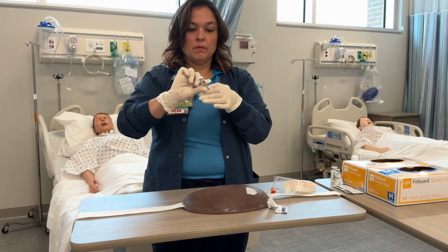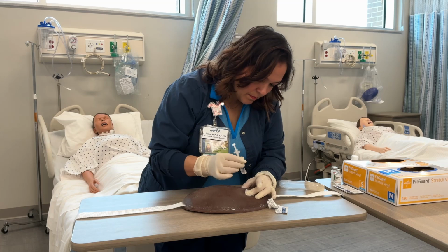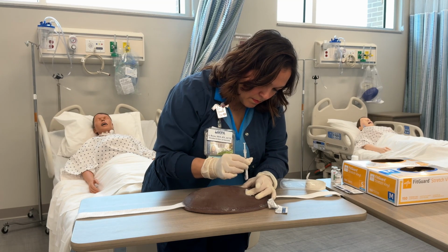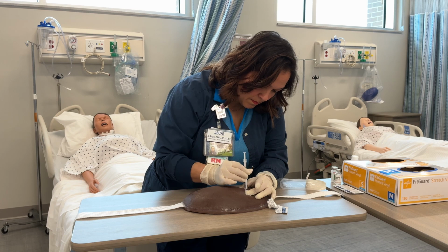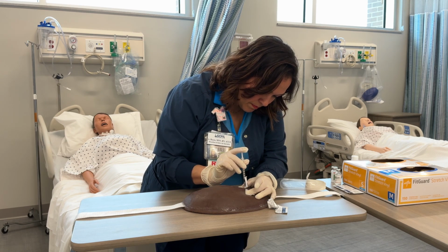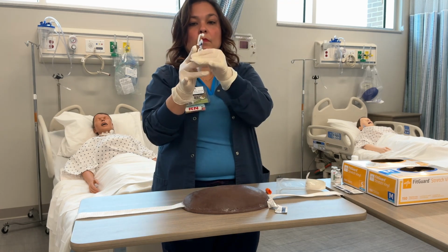We're going to pinch up a fold of skin at the injection site, holding the syringe with the needle bevel up at 45 to 90 degrees, depending on our patient's size and the length of our needle. We are not going to aspirate this. We're going to tell our patient we're about to stick them and inject the insulin and then withdraw the needle. We're going to engage our safety device.